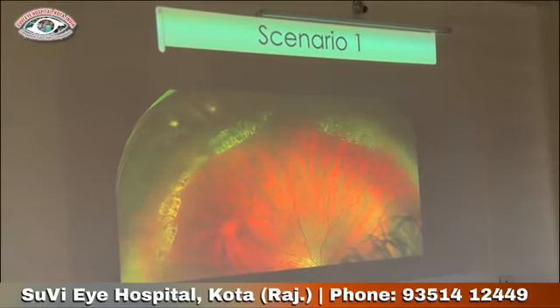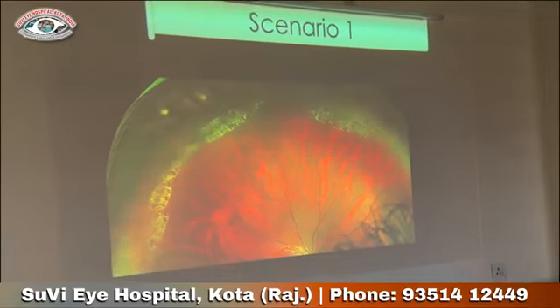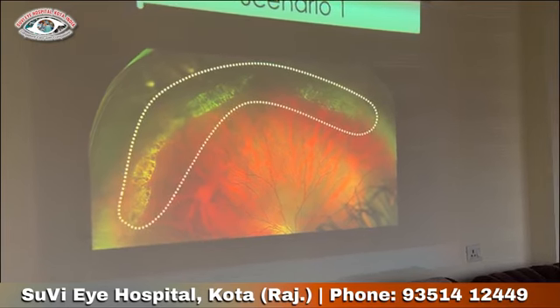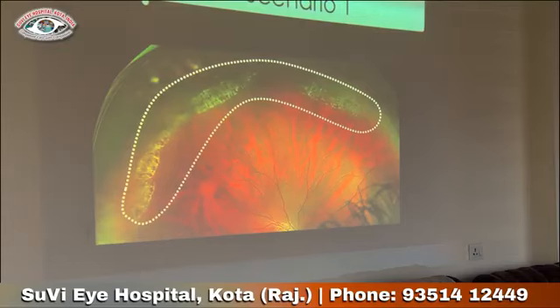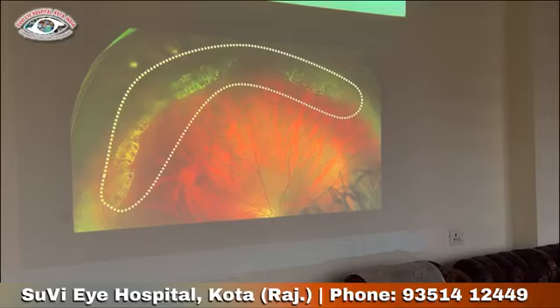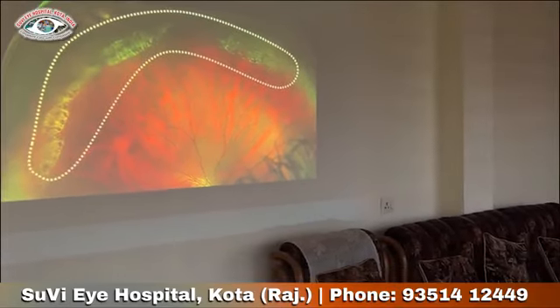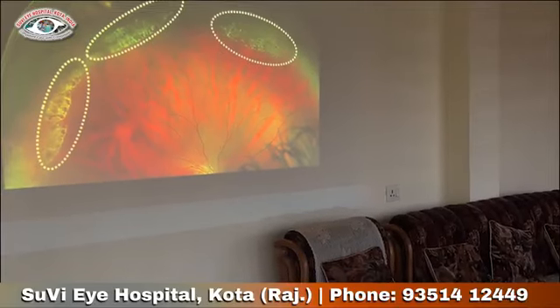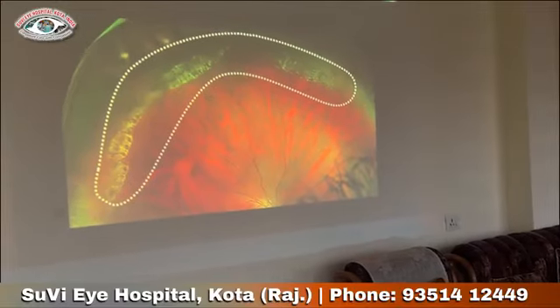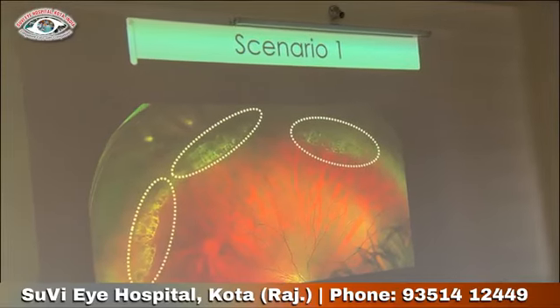You can see there is a large lattice. So how will you approach this patient? It should be approached like this. You can enclose it in one laser setting like this one shown in the area. This is wrong because sometimes in between there is a gap. So we have to cover each individual lattice where possible.